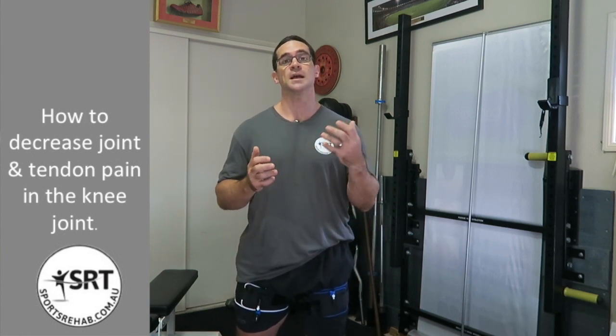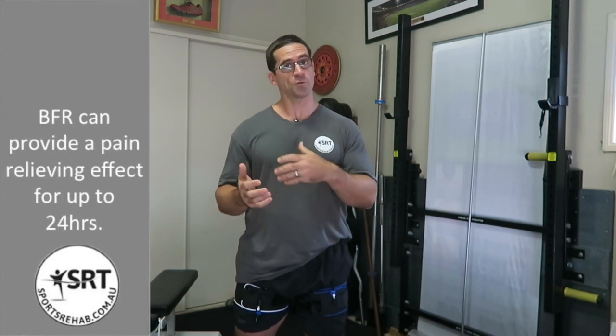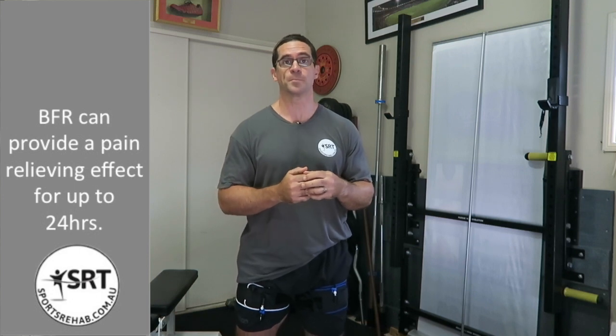Today I'm going to show you a short little video on how to use BFR cuffs to decrease tendon and joint pain in the knees. There's a lot of evidence out there at the moment about the role of blood flow restriction being able to attenuate joint and tendon pain. I've also had a lot of feedback from clients who currently use BFR that this same effect happens for them, with up to 24 hours of pain relief.